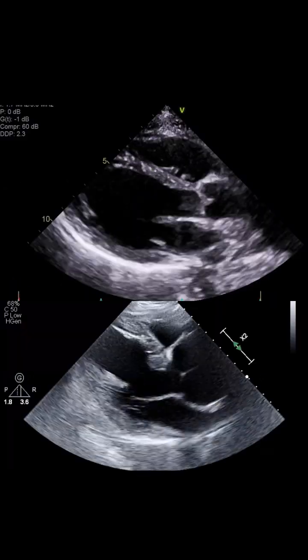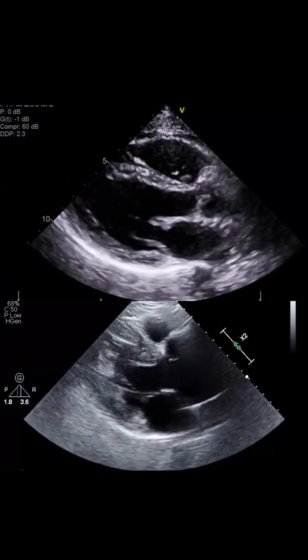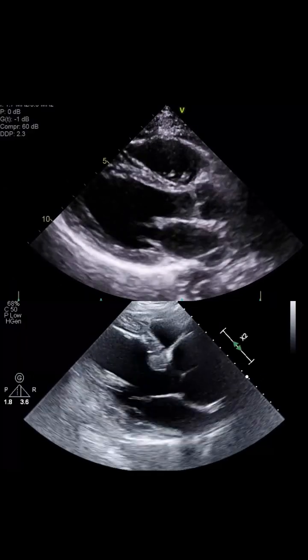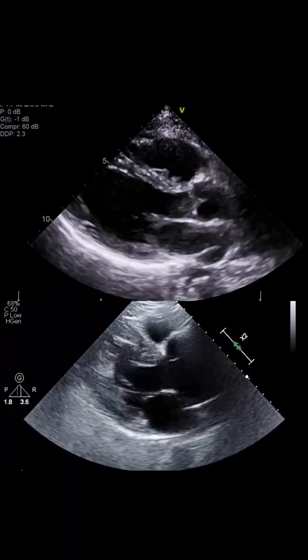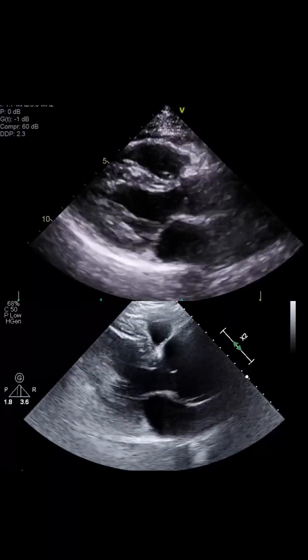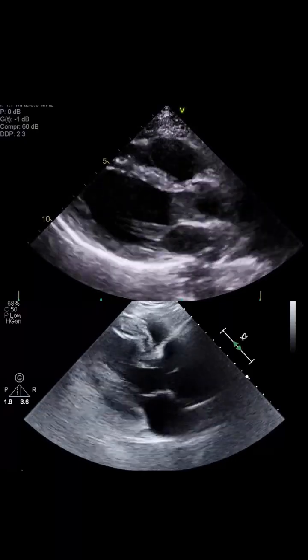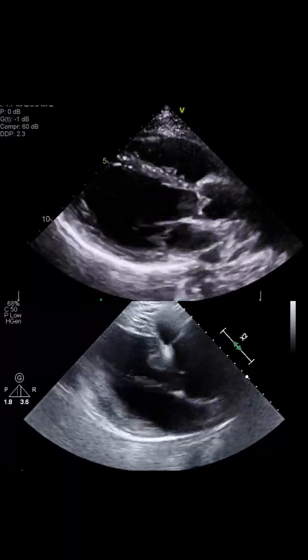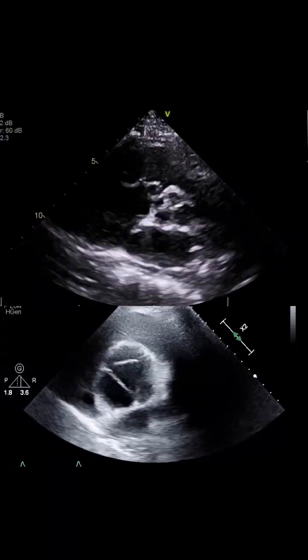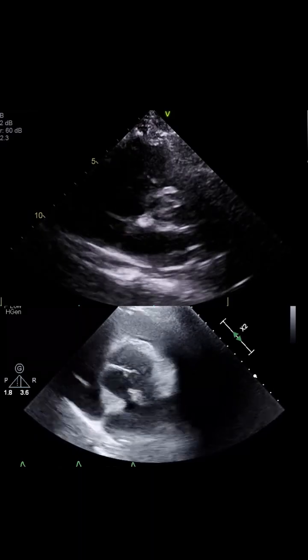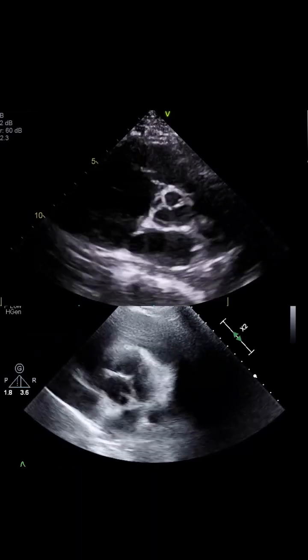When compared to a normal aortic root, the difference is obvious. Compared to a normal short axis view, the dilated root below is visibly stretched.